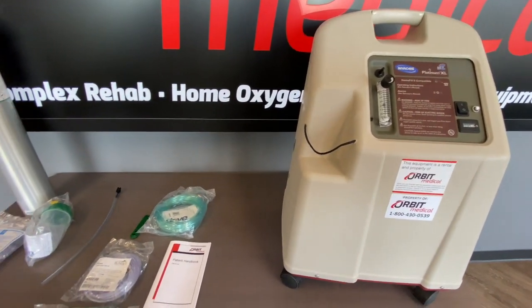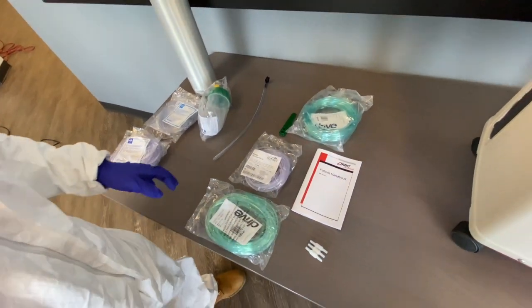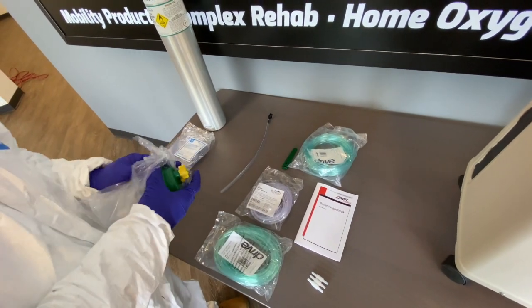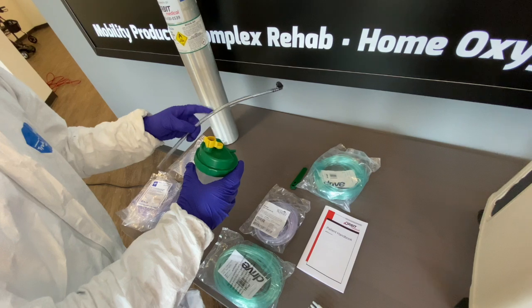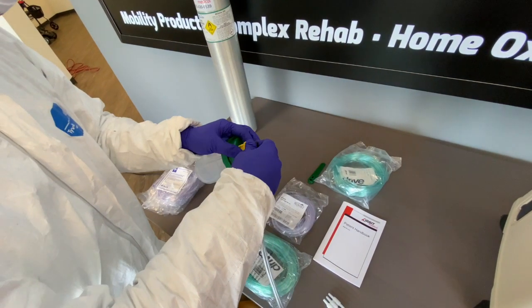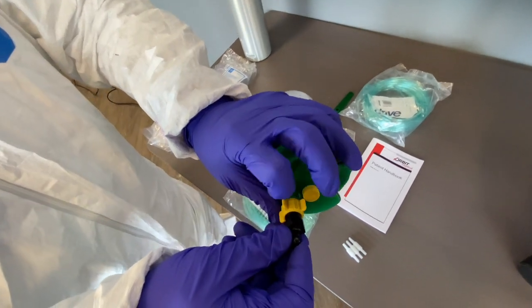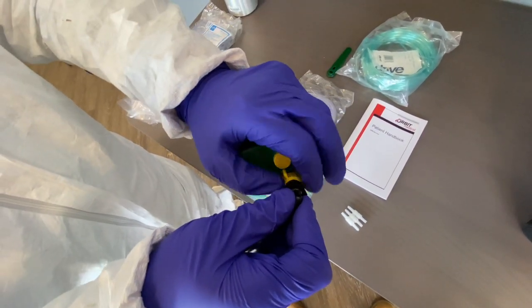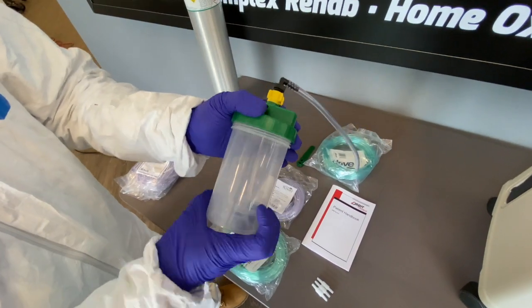On the table here in front of me I have the humidifier bottle, which I'm going to open up first. We also have the connector, and as you can see I'm just going to turn it to connect both of them together.